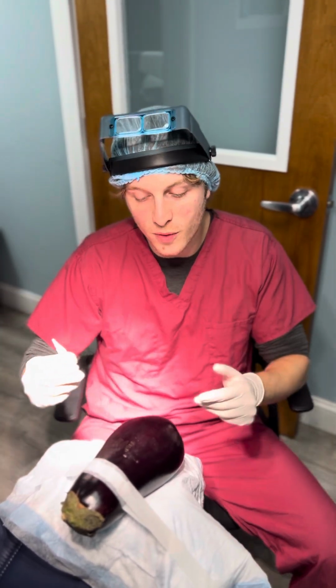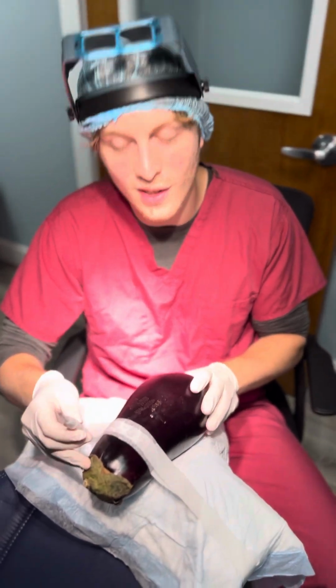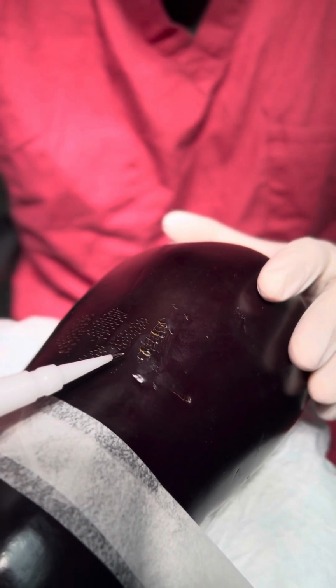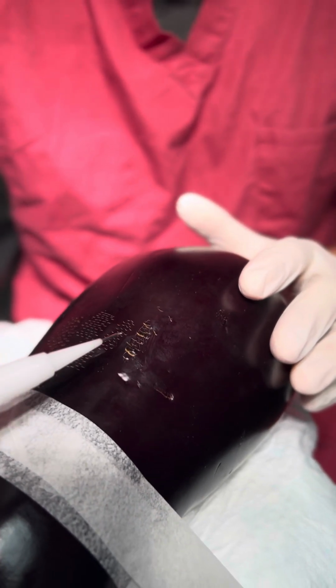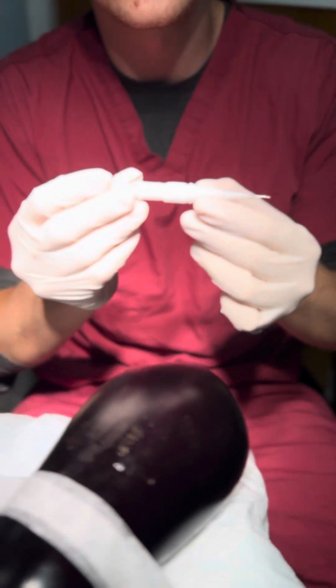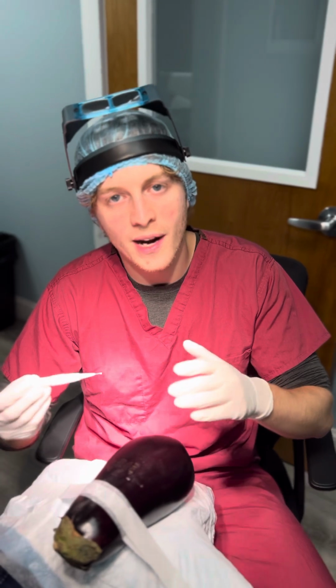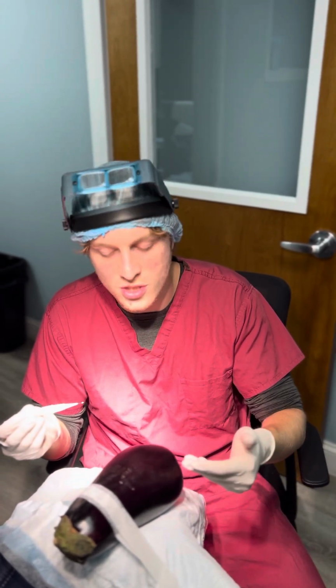So the first, I want you to have a look at our lovely patient here, this eggplant, and I want you to focus your attention just on these incisions here. These are the incisions that we made using this implanter pen. This is a new device that was sent to us that we thought we'd test out. We're always looking to advance our practice and keep up with the latest devices and technology. So we thought we'd give it a go, and we thought we would compare it to our own style of creating incisions.